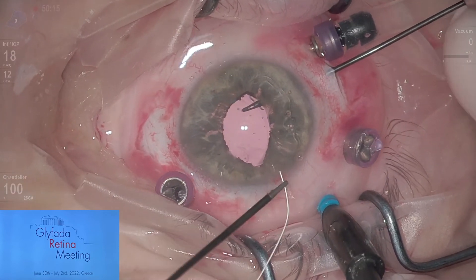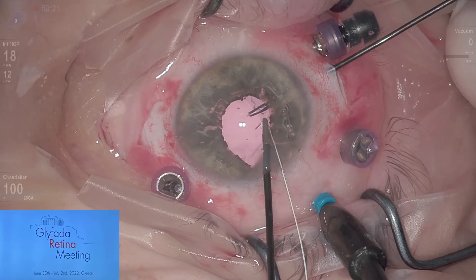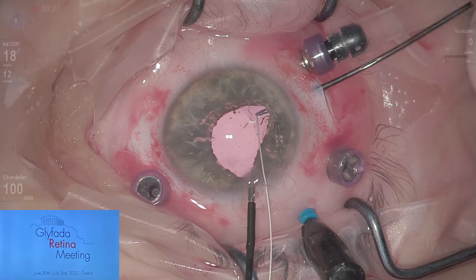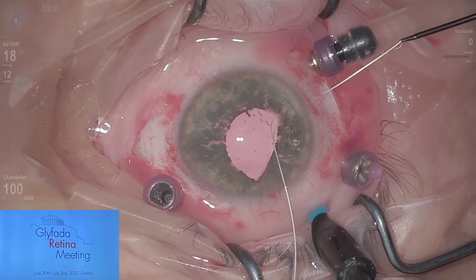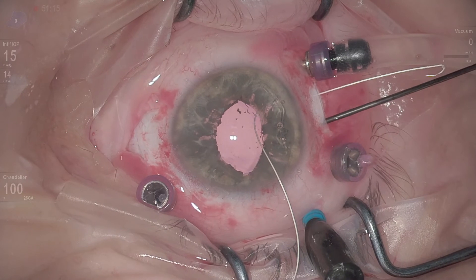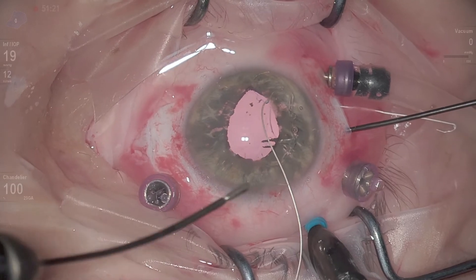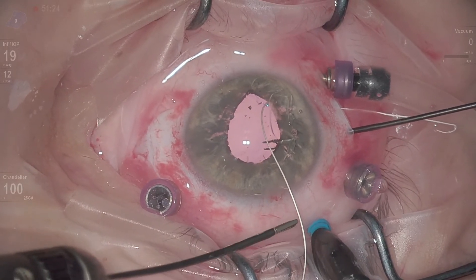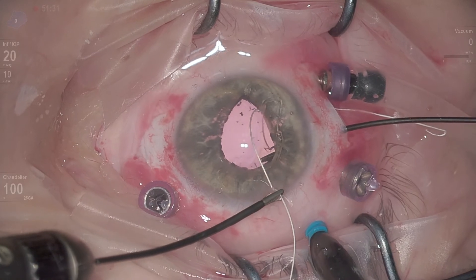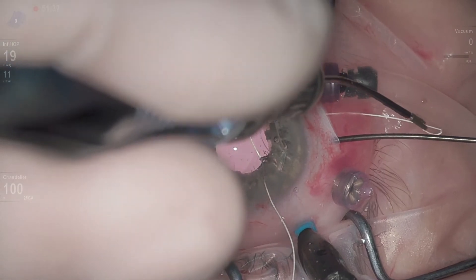So yes, it was a complicated implantation of the Carlevale. When it goes perfectly well it is fast and easy, but when we amputate something from the lens, this is where the problem starts. This is one point probably against the Carlevale — it is not pre-loaded and it is a lens received without a dedicated injector. Nowadays from MD Tech it comes with an additional injector, but I still think this is something that might be improved.